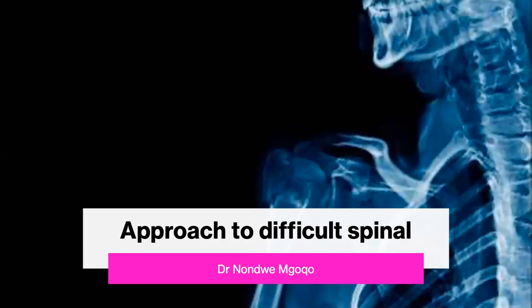This is particularly the case if the spinal anatomy is altered or obscured by factors such as obesity, spinal deformities, or even previous spine surgery. This technical difficulty can result in procedural failure, suboptimal epidural analgesia, and even increased needle trauma.